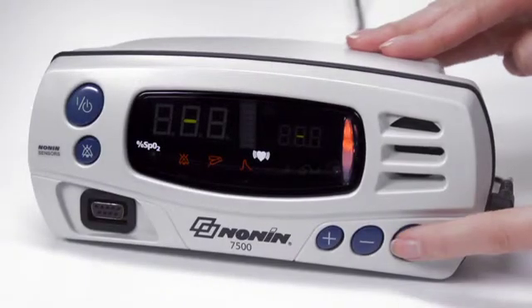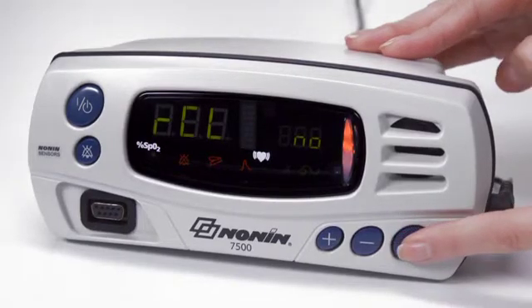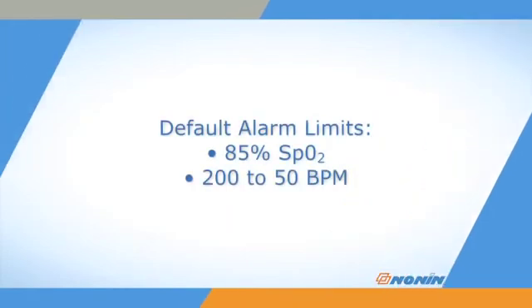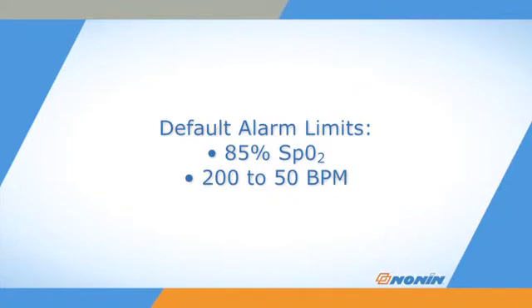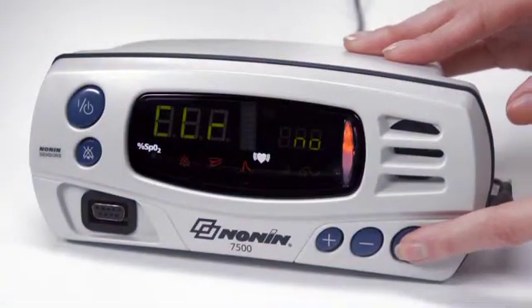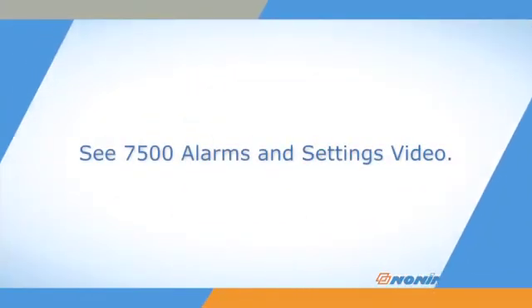It is recommended to set and check alarm limits and other oximeter settings prior to each patient use. The oximeter comes with a default low alarm setting of 85% SpO2, a high pulse rate of 200 beats per minute, and a low pulse rate of 50 beats per minute. These may be customized in the setup mode explained in the alarms and settings video for this oximeter.